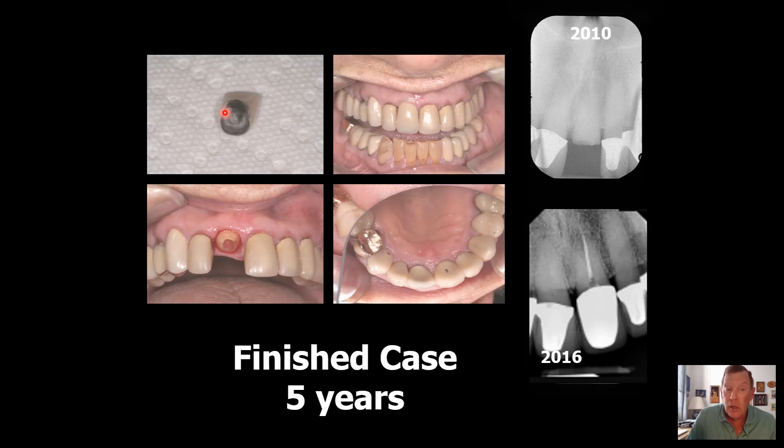You could see here that in my permanent crown, what a great grip I have on the root below the gum, and I let this patient wear this permanent crown on a trial basis with rubber. It did not fall out, and then I cemented it in permanently. And this is five years afterwards — you could see it looks like the day it was put in.